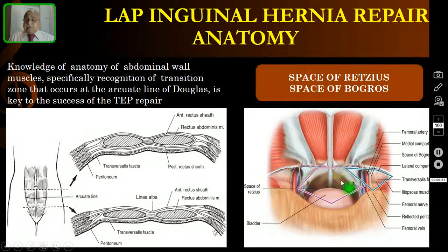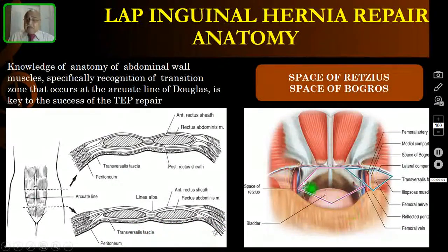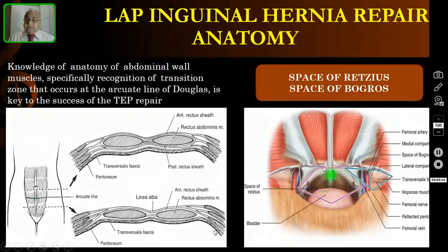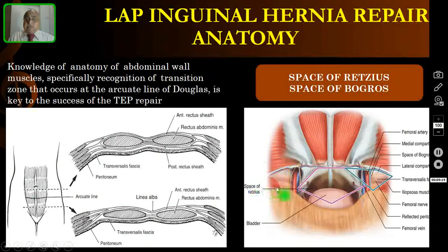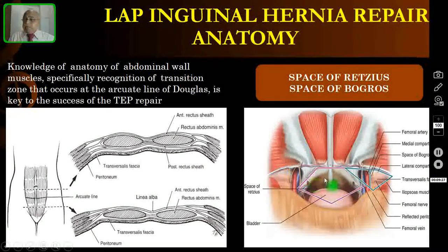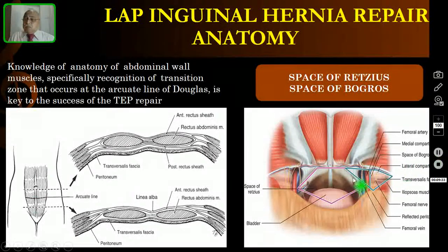After entering into the anatomical space, you have to go towards the pelvis where you will see the pubis. The space between the pubic symphysis and the bladder is called the space of Retzius. Then you have to go laterally — this is a diamond-shaped space — and this lateral space is called the space of Bogros. Both these dissections are very important in TEP repair.